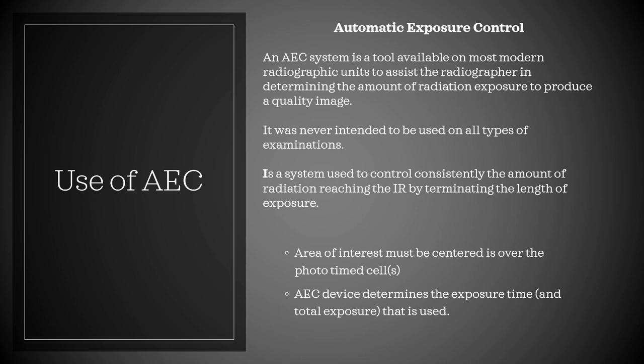Area of interest must be centered over top of the phototimed cells. The AEC device determines the exposure time and the total exposure that is used.